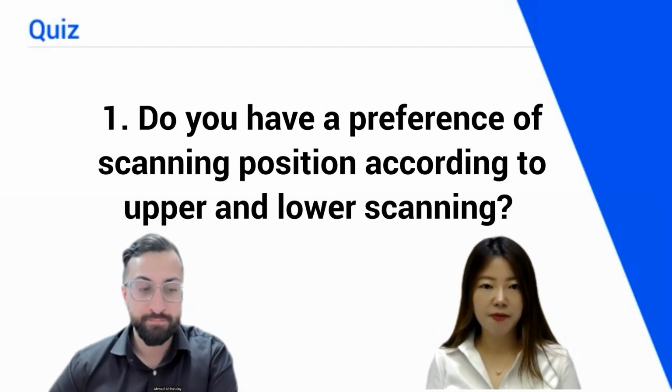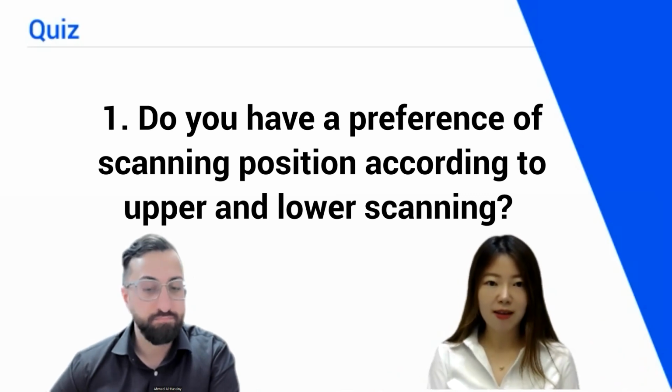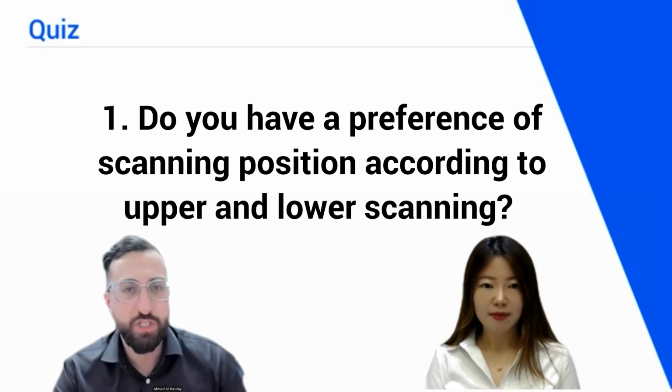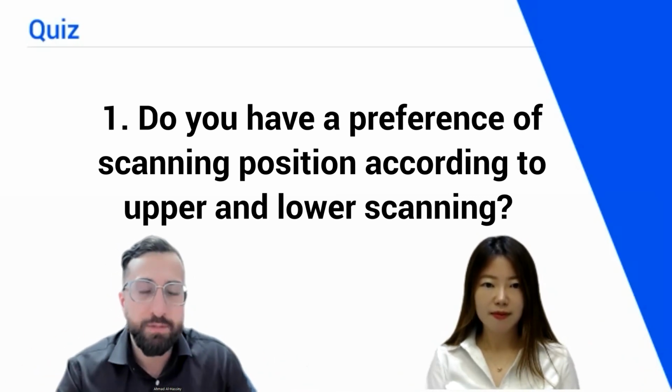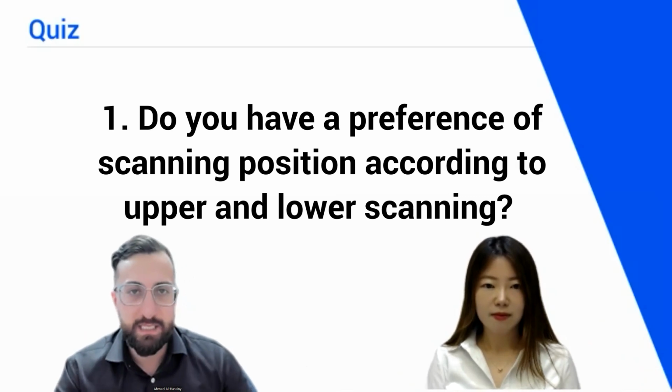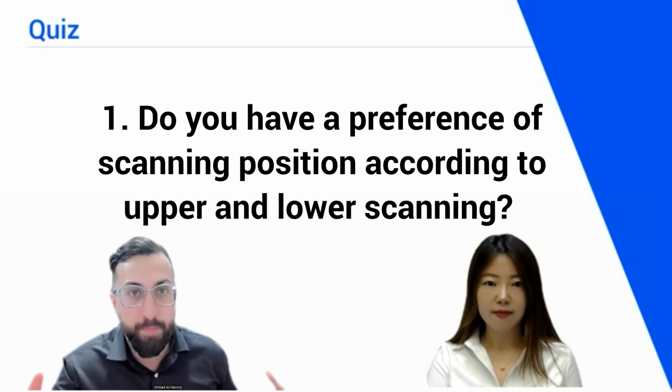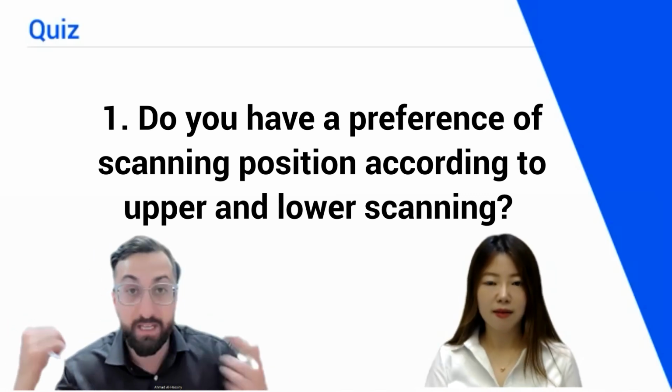That means even for upper and lower, you stay with the same position, right? Always the same position. And more importantly, about positioning that I really want you guys to conceptualize is I've seen some dentists where they don't get a scanner cart and they have their laptop on their desk or something like that.